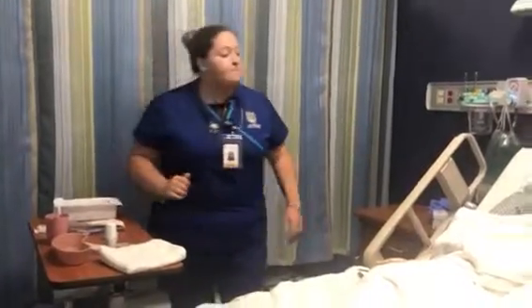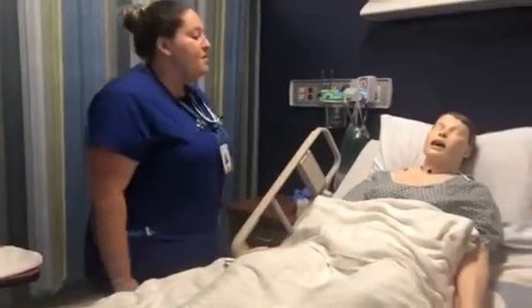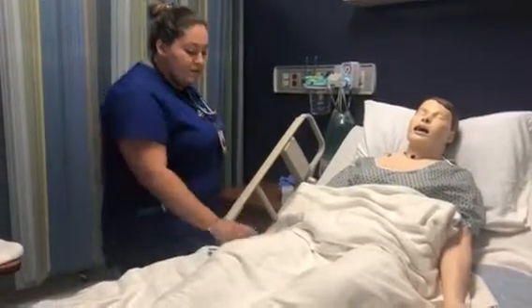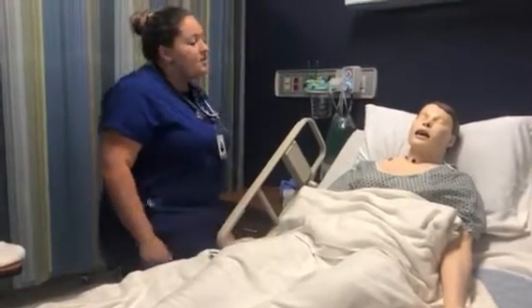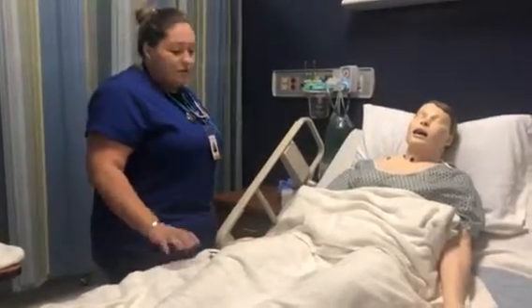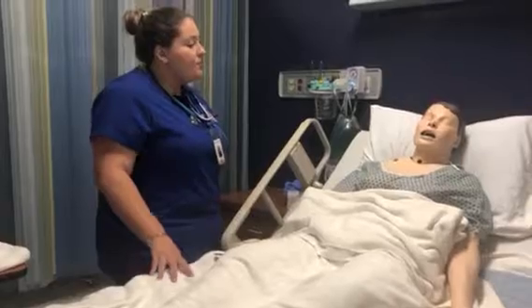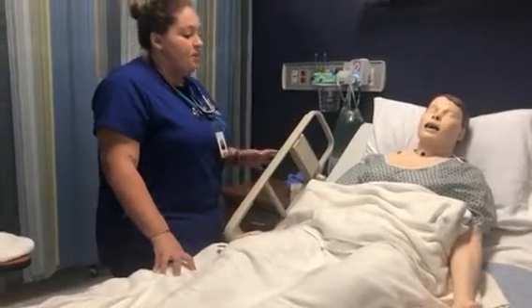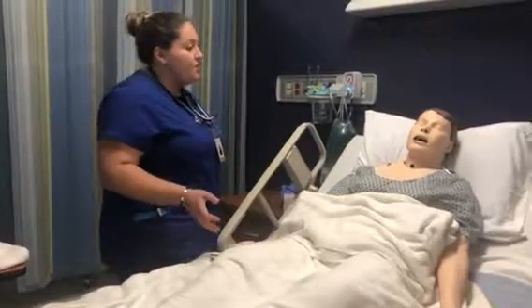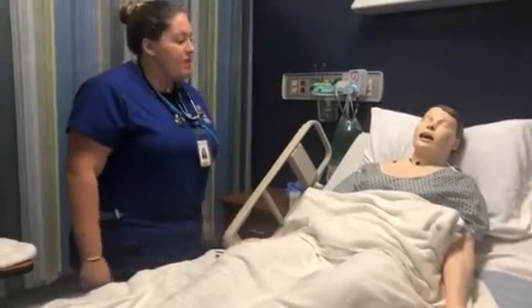clean surface. Hi, Mr. Smith, my name is Milana. I'm going to be your student nurse today. May I please just verify your name and date of birth against the wristband? Everything looks good. According to the doctor's orders, I'm just here to place an NG tube to make sure you get the proper nutrients to be able to perform feeding for you. Once we realize that you're able to properly feed on your own, we will remove the NG tube.